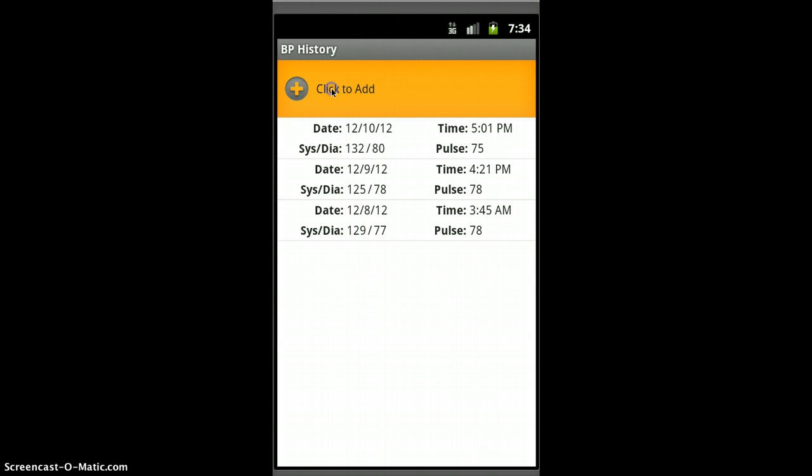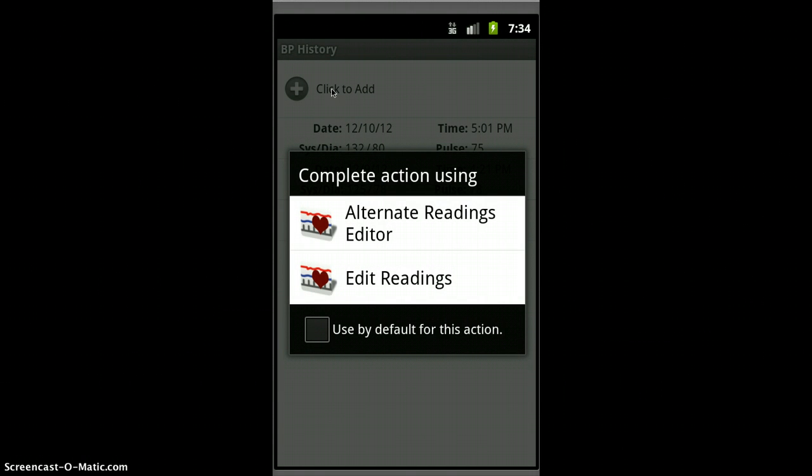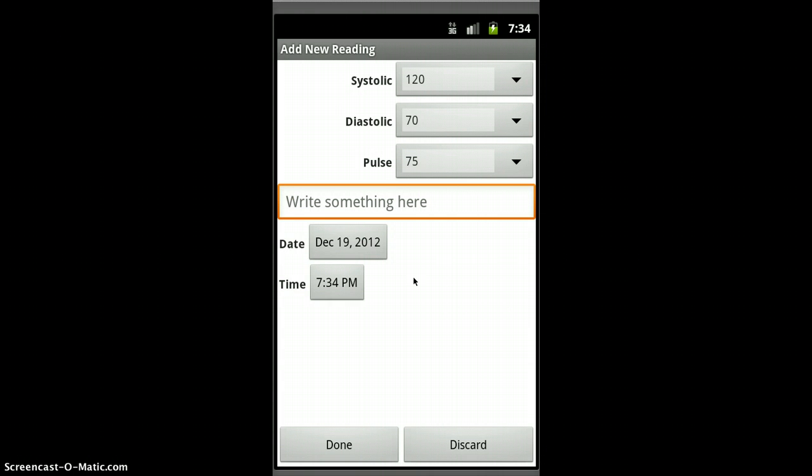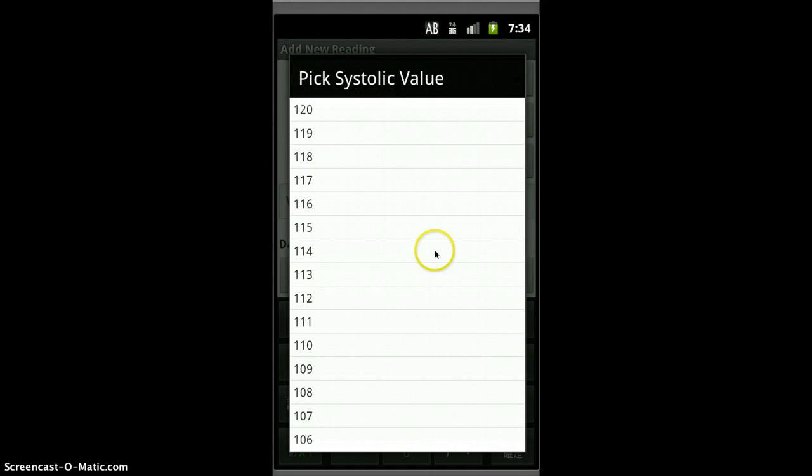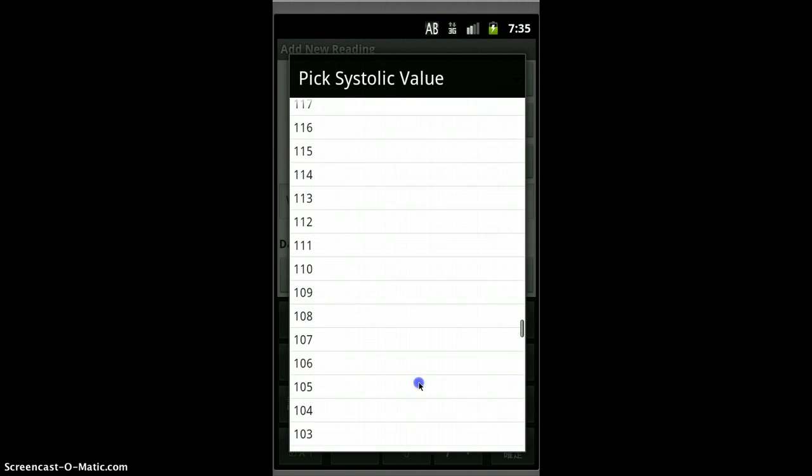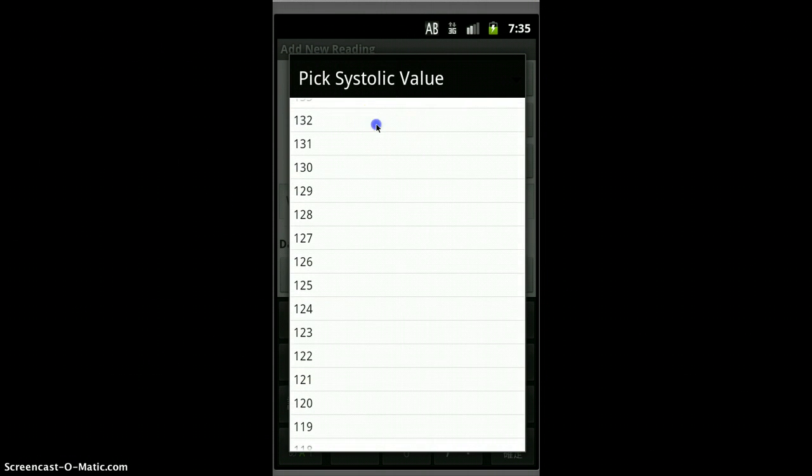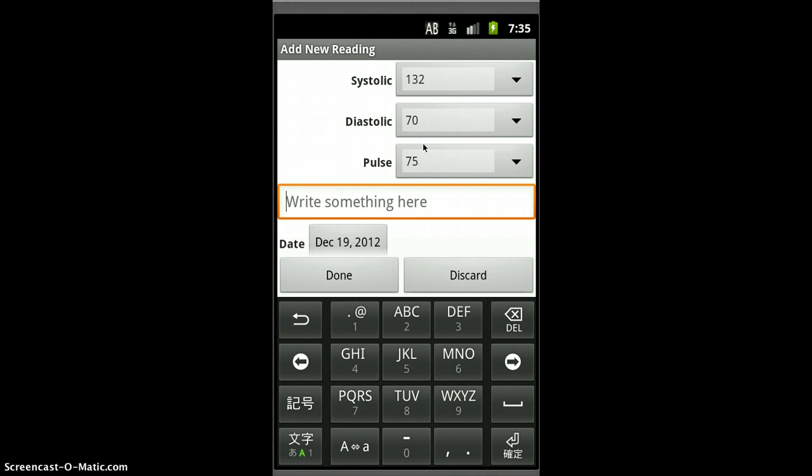So you press on click to add, and here if you haven't made a choice, you have two different methods that you can enter your data. One is the original that's called edit readings. It uses what's called a spinner in Android, and this spinner you can move it and choose things. The values that come up here used to be fixed values that I made up.